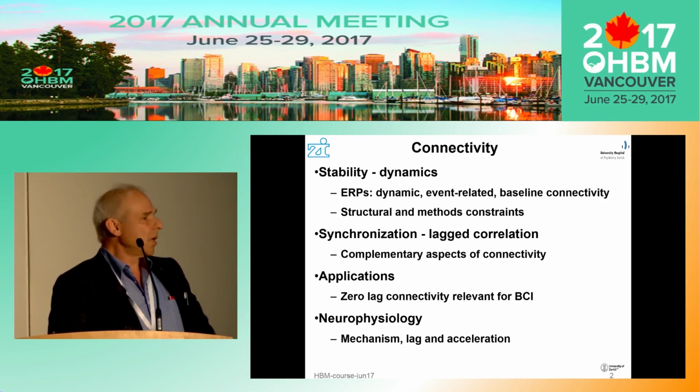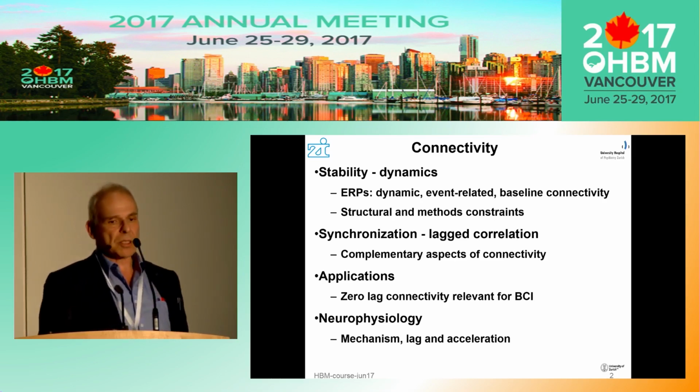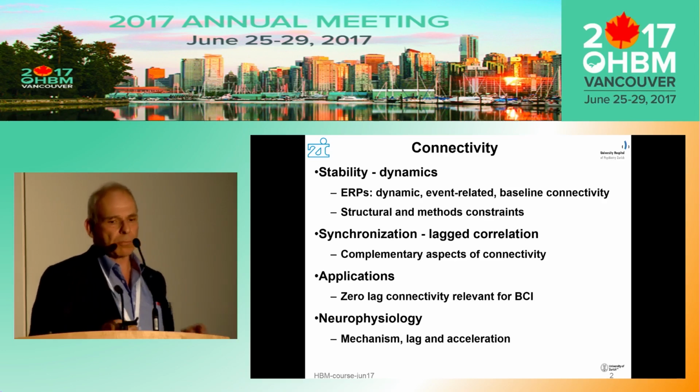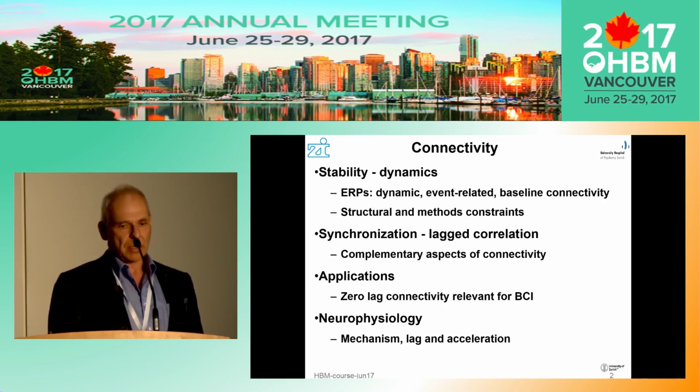So essentially we think that in the field of connectivity, if you look at EEG and ERP analysis, particularly ERP analysis, you have an underlying stability of structure, but if you want to describe the dynamics of connectivity you have to be aware that you have an evolution that depends on a baseline connectivity. You also have to consider structural and methodological constraints and limitations, things that probably no single method can really resolve if you want to get at causal inferences about your data, about what causes what.